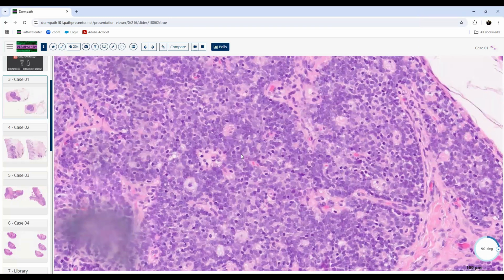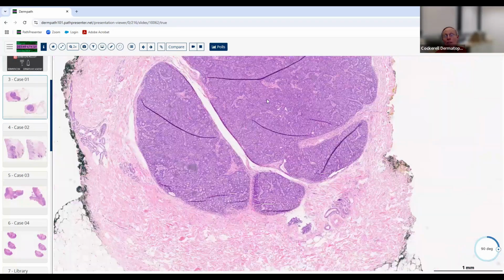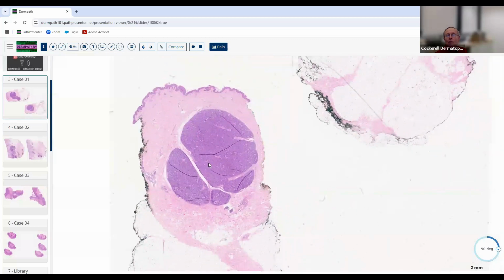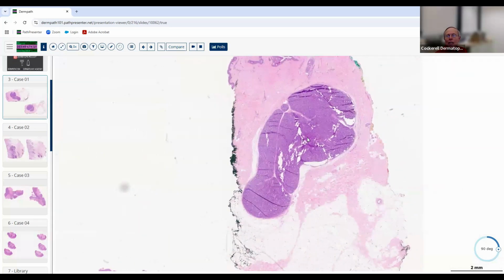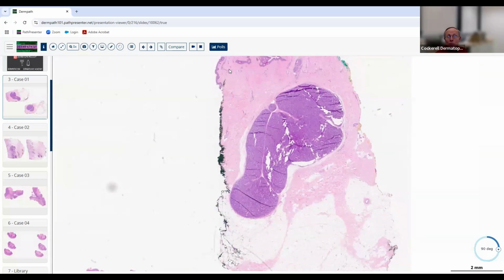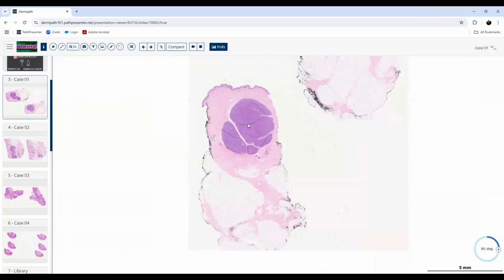It's a pretty rare bird. We don't diagnose it very frequently. We don't see it very frequently. And of course, clinicians have zero clue as to this. They have no idea what they're dealing with, and they usually think these are cysts. Whenever a clinician encounters an adnexal tumor in the dermis, they feel like cysts. They're rubbery. Of course, a spiradenoma is one of the painful tumors. This lesion is not painful. They think it's a cyst, and they might just do something like a punch excision or whatever, try to get rid of the entire thing. So that's cutaneous lymphadenoma.